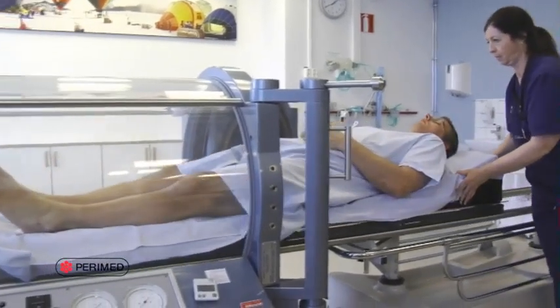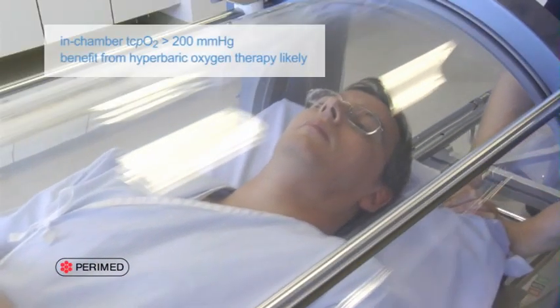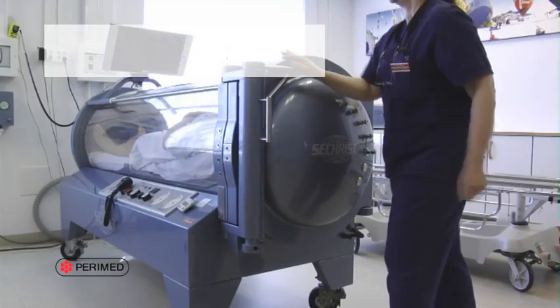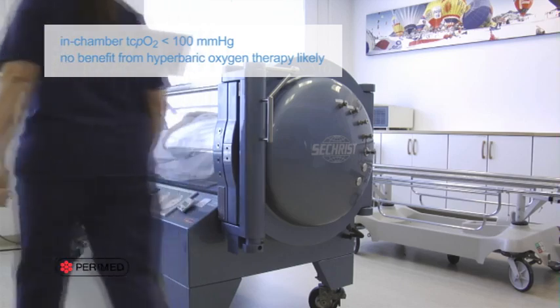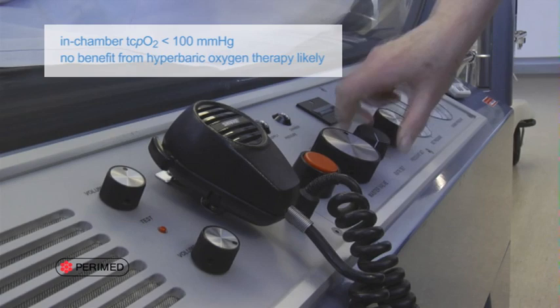If the in-chamber tcpO2 value is greater than 200 millimeters of mercury, this indicates that the patient is likely to heal with hyperbaric therapy. Conversely, in-chamber tcpO2 values less than 100 millimeters of mercury are closely associated with the failure of hyperbaric therapy. The in-chamber tcpO2 test is 75% accurate at predicting benefit from hyperbaric therapy. Although these data come from diabetic foot ulcer studies, they seem to apply to other types of wounds.